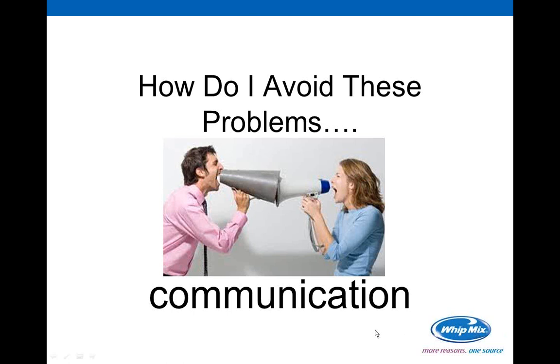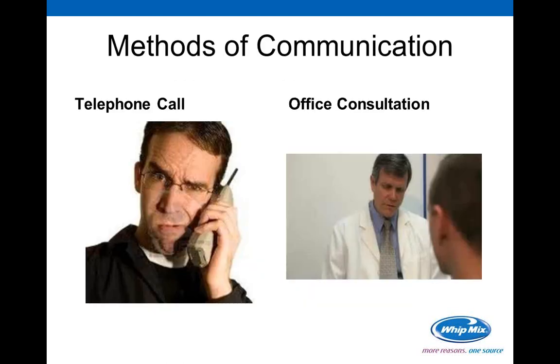We're not getting the information transferred from you, the laboratory, about problems that you foresee to the doctor in a meaningful way that will make him reconsider where the impression is and the information that's been captured and the problems that are going to go forward with this. And that needs to be noted right up front. All right, so how do we do it?